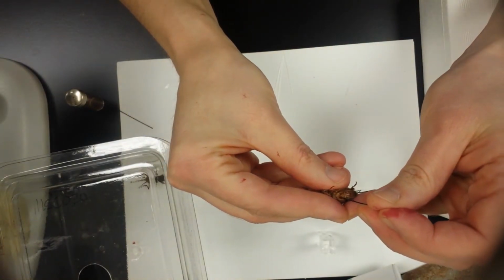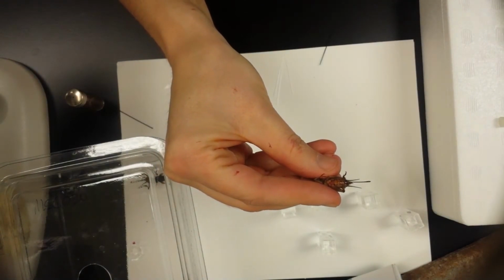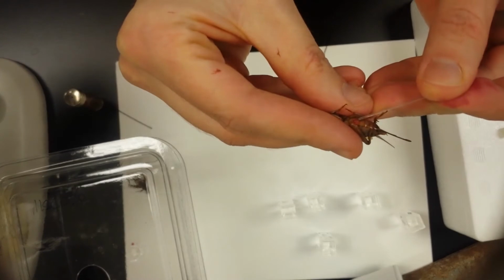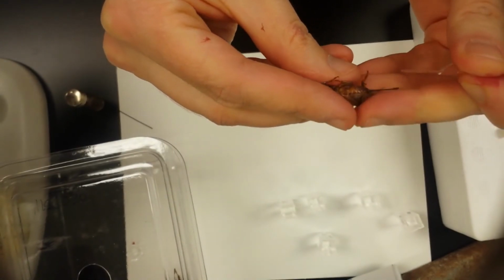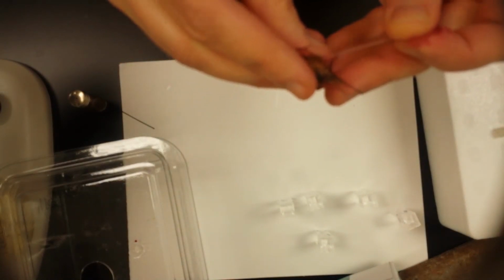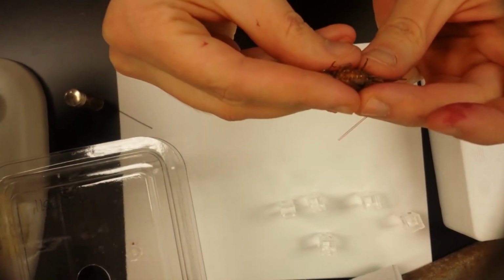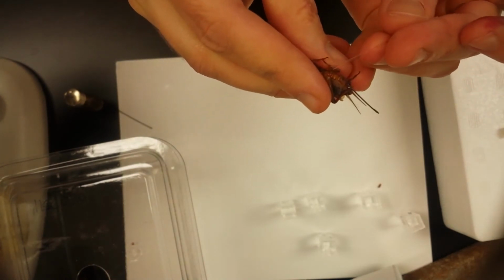Okay. Give her a poke, and very quickly there, a big drop of hemolymph has welled up. So I'm just going to put this microcapillary right up against that. It's going to get drawn in. It's not quite 10 microliters, so there's a little bit more. Just trying to touch just the tip of the microcap, and get even just a little bit more to well up.